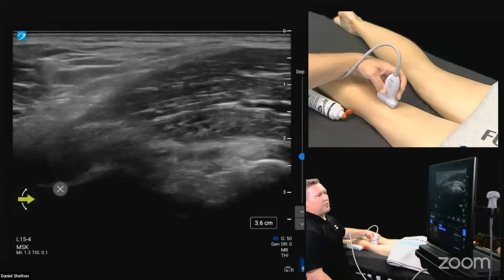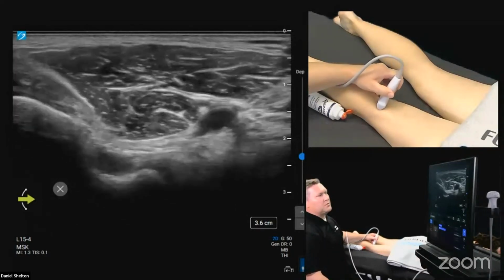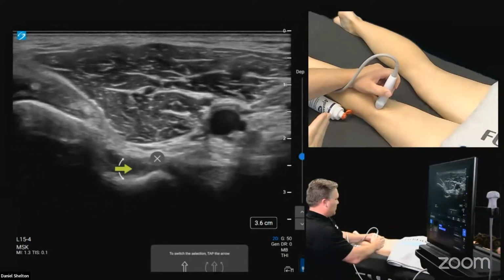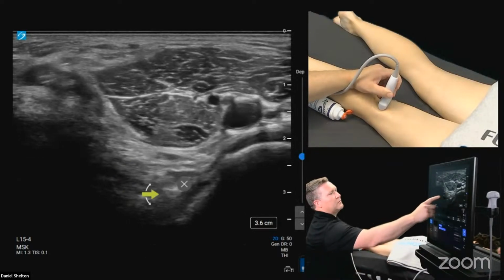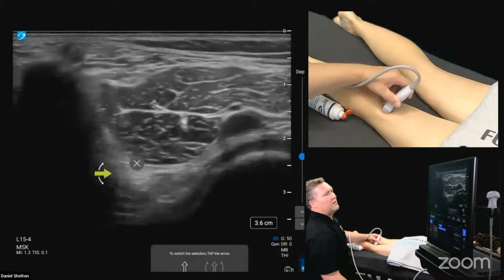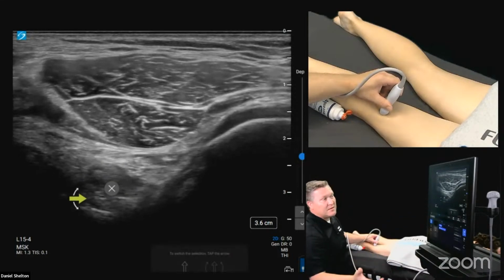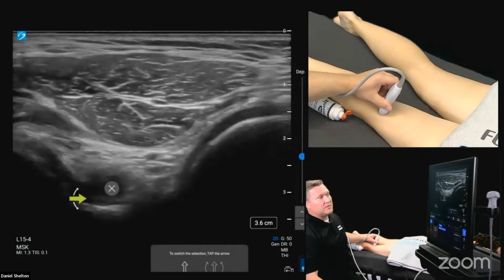But if you were to take the probe back to short axis, let's go back to the tibial portion. So we're on the tibia. We're at the distal enthesis of the PCL. So here's the PCL. And I'm just going to jump across the joint line, and we're just following. And you'll see this dark oval start to hug the medial femoral condyle. And that's about as great a view as most people typically can get right there. That dark oval is what you're going for. So that's not a cyst either, just as a pitfall.